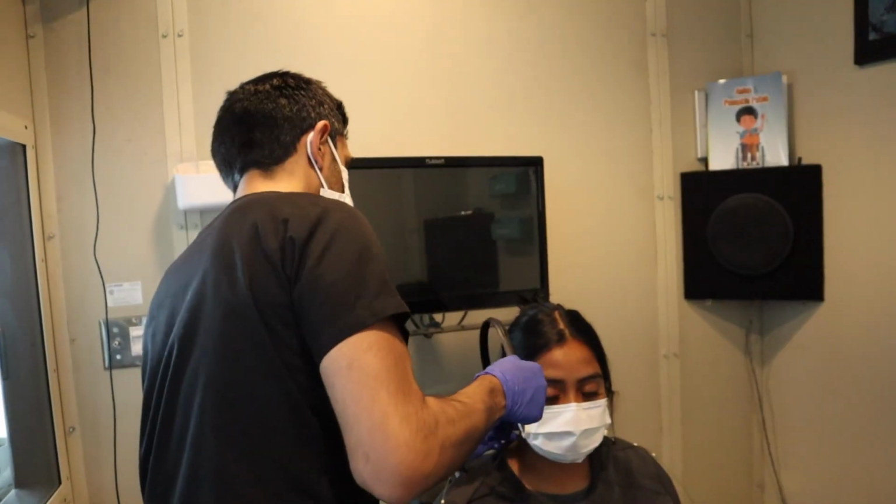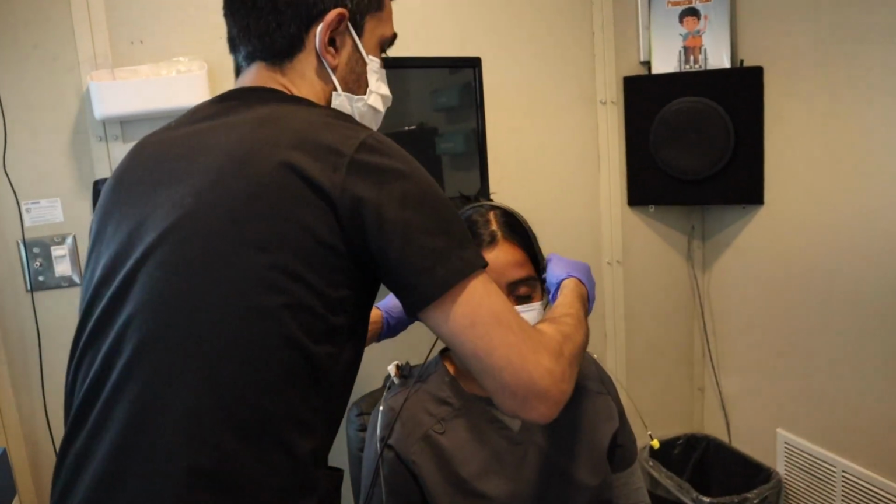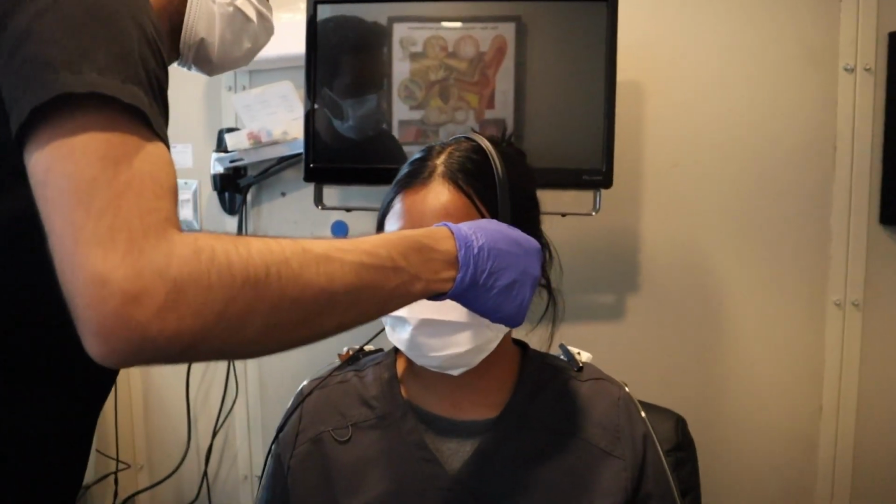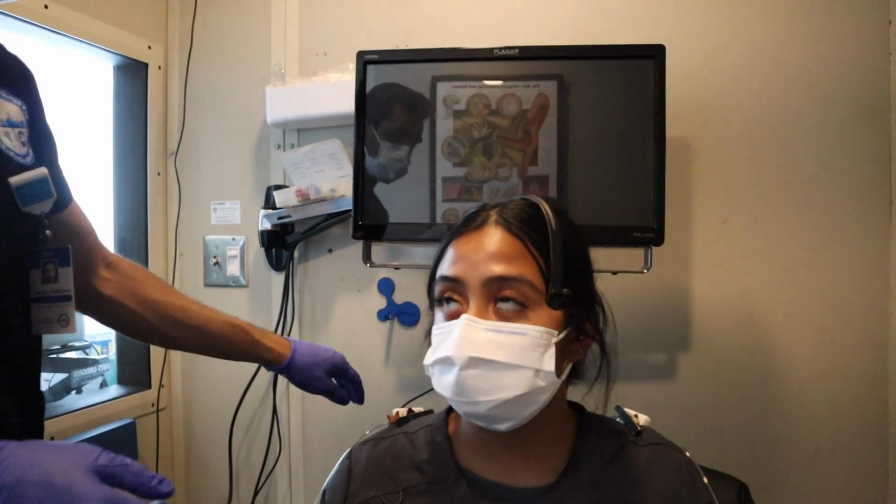Then we move on to our classic pure tone testing. So pure tone testing is when we have the patient listen to various beeps across the speech spectrum, all the way down from 250 hertz, which is a very low, bassy tone, up to 8,000 hertz, which is a very high-pitched treble tone. And what we're assessing is what is the softest level that they can hear that tone at least 50% of the time correctly. That's what we mark as a threshold.